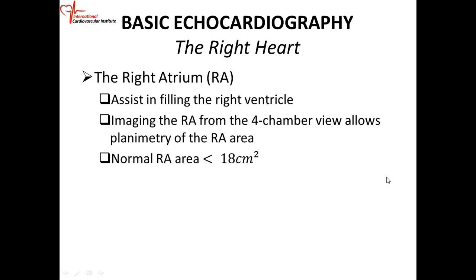And then we spoke about RIMP, right ventricular index of myocardial performance, and we went over first the definition of RIMP and what is significant.